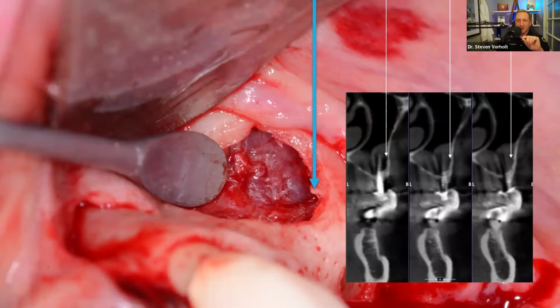And I could just see this little notch on the internal surface, or the medial surface, of the lateral border of the maxilla. And sure enough, when we did the surgery, there with the big blue arrow, you can see the exact anatomy that we were seeing on that CT at a 0.2 voxel. So don't discount a 0.2 voxel. It's still very accurate. It's still very useful and clinically relevant. And it's enough to see big anatomy or small anatomy, like in this case here.